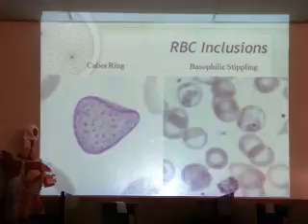So, patients who may live in an area where water is contaminated with lead, there was some scare about that on the Big Island a few years back, yeah? So all the kids were tested for lead levels, and they may also have looked at the red cells for this kind of stippling.